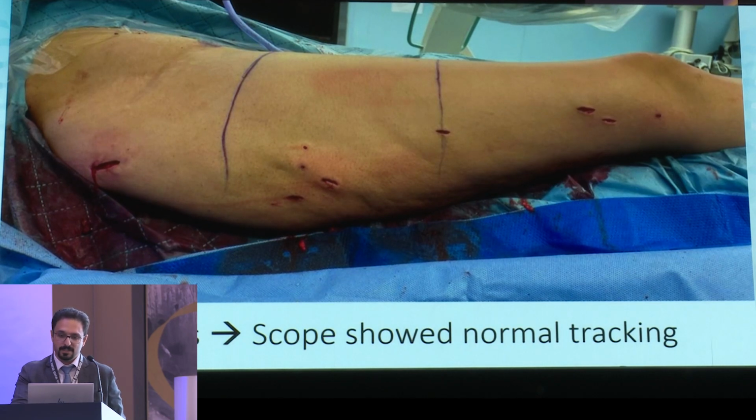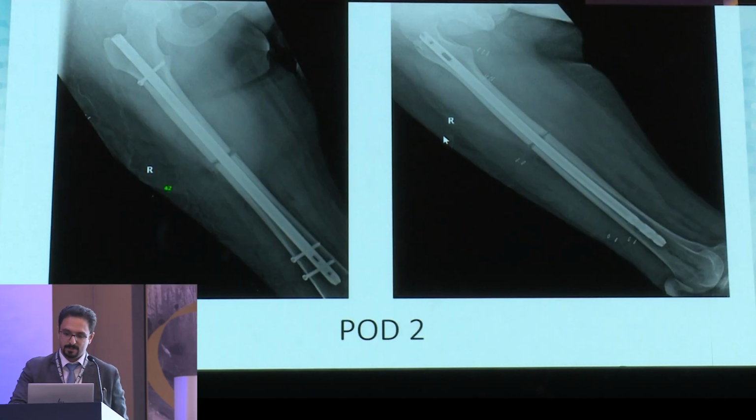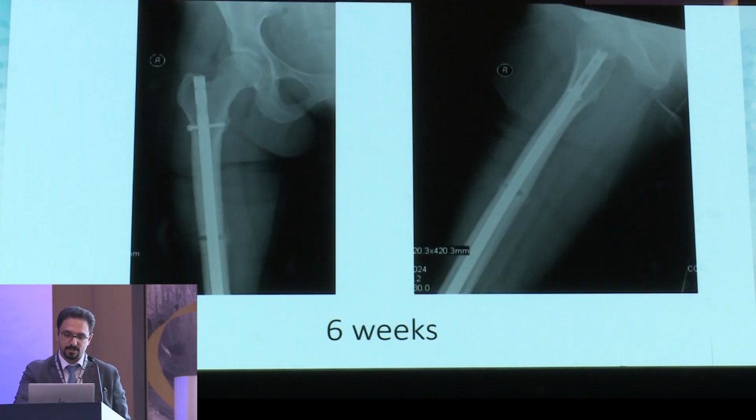And these are the incisions for this surgery. The middle incision is, this incision is where we do our osteotomy. All right, and this is post-op 2 days. At 6 weeks, you see good callus already, and the patient is full weight bearing immediately post-op. She's feeling the pain is gone. Very early post-op, and all the mal-tracking feeling is gone also.